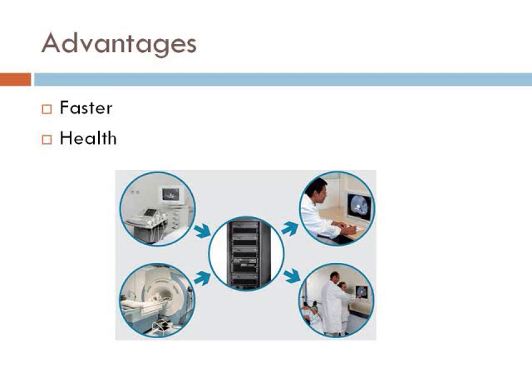The other advantage is that it's good for the patient's health. With the old way of technology before, patients sometimes had a lot of exposure to X-ray if the hard copy film was lost, or the image wasn't very good, if the contrast was bad or the zoom wasn't good enough, then the patient had to retake the X-ray. This eliminates that constant exposure to radiology. The patient doesn't have to take all these repeat X-rays, for instance.